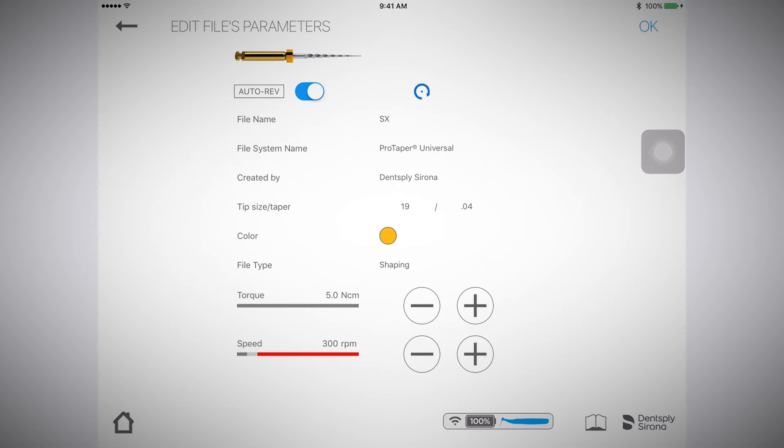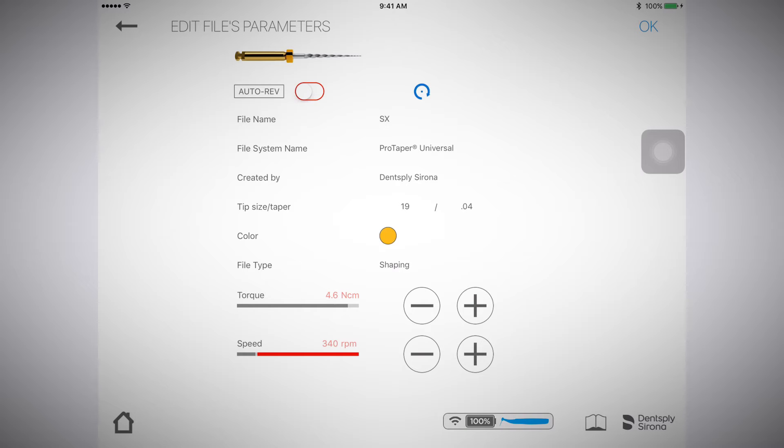I now have the ability to either edit the speed and torque of the file or turn off the auto-reverse functionality by selecting the paper with pen icon.